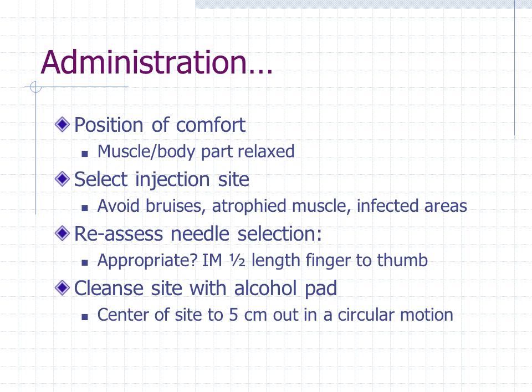Make sure the client is in a comfortable position and encourage them to relax the muscle. Select the injection site, avoiding bruises, muscle that has been atrophied, or any areas that are infected. Make sure that you have the right needle size.